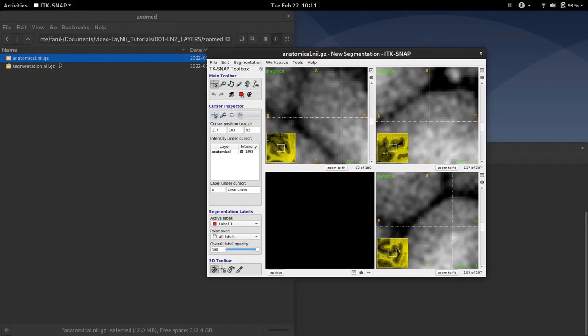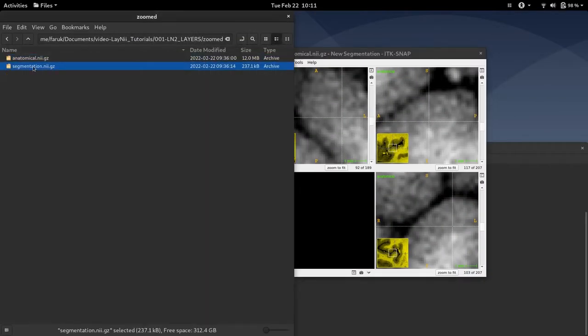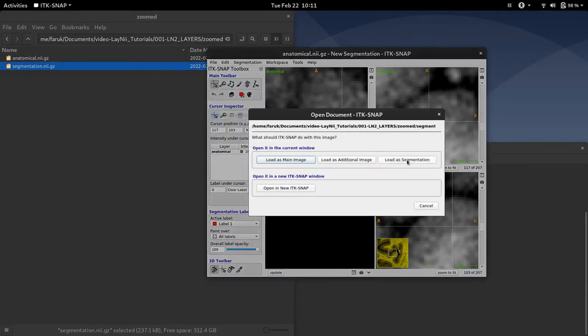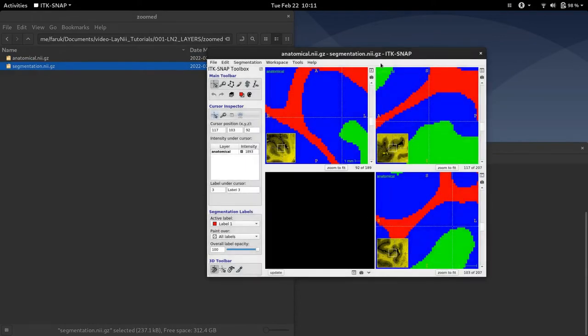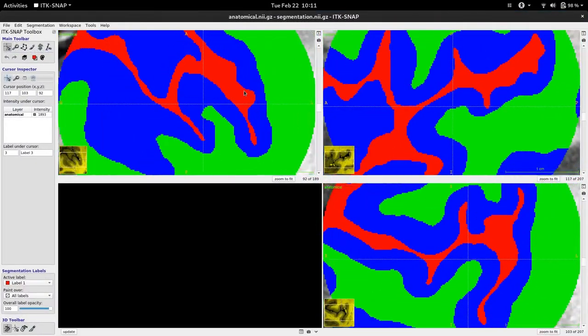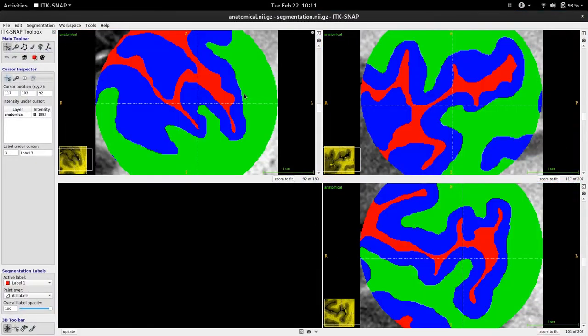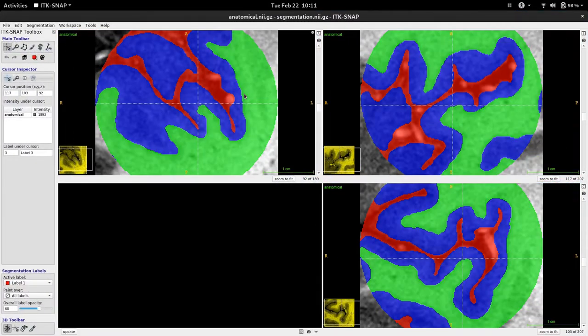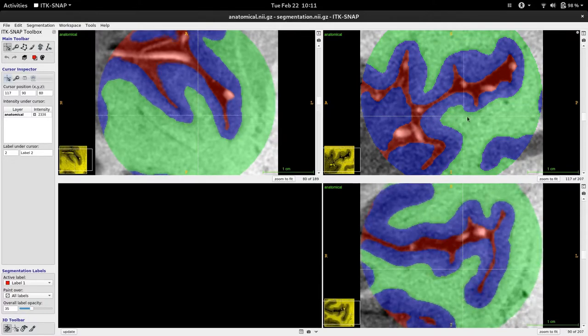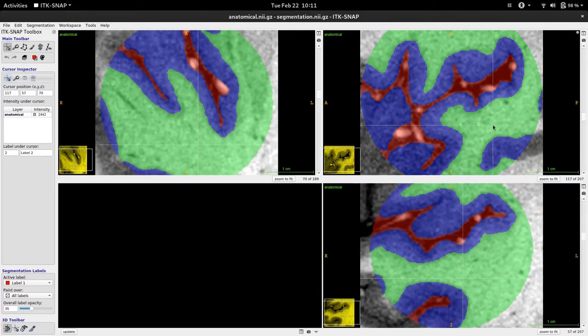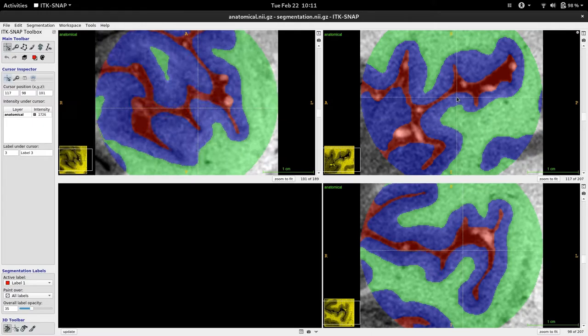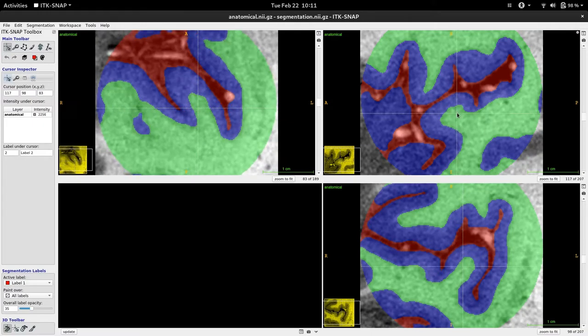So now I'm going to show you my segmentation of this region. And this is the only output we need to compute layers in Laney.